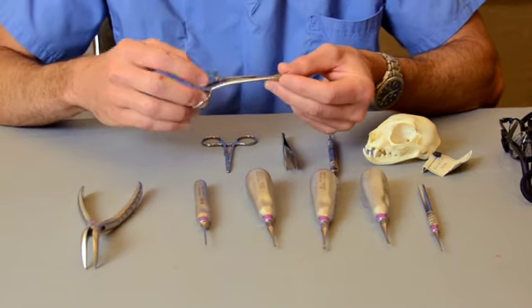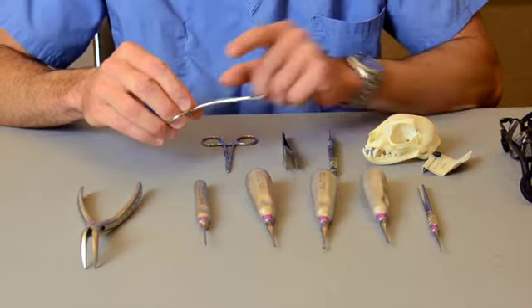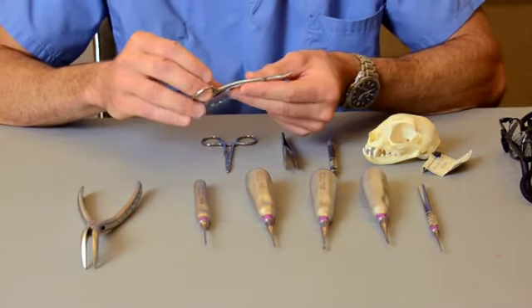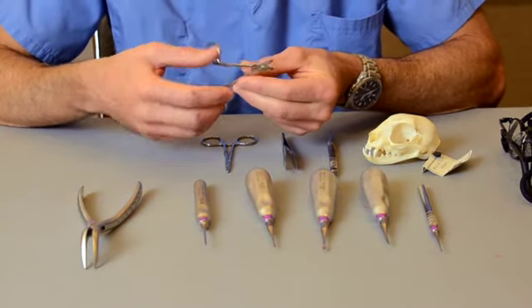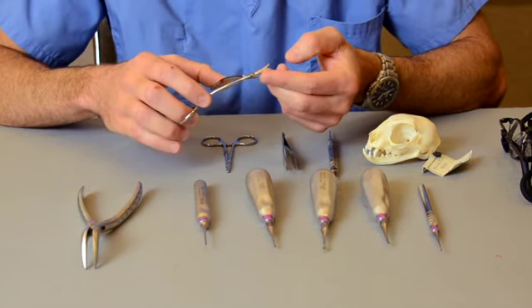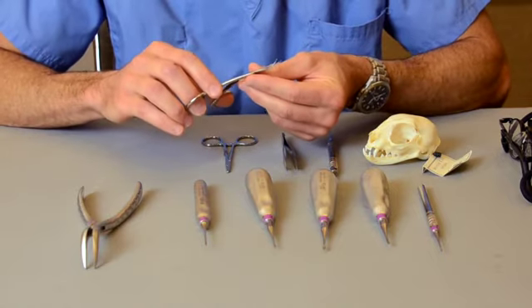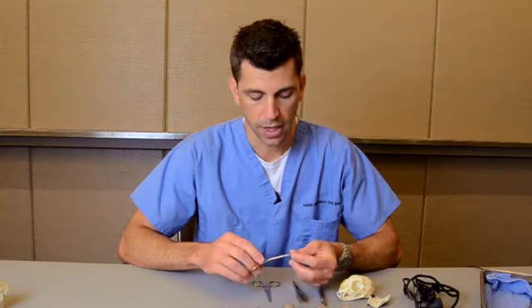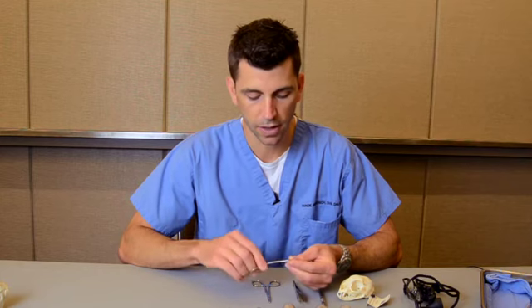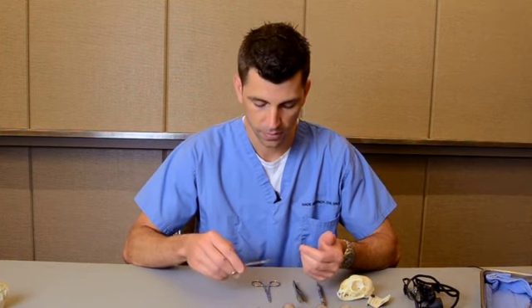This is a very fine tissue scissors. Specifically, it's called a Lagrange scissors. That's the style. It's got a double curve to it, which provides some increased ergonomics when working in the mouth. It has a serrated blade on one edge, so that helps when trying to cut through some of the dense or tough gingival tissue, and it allows us to make fine cuts and excisions in the tissue, as well as releasing underneath the flap during a periosteal release.